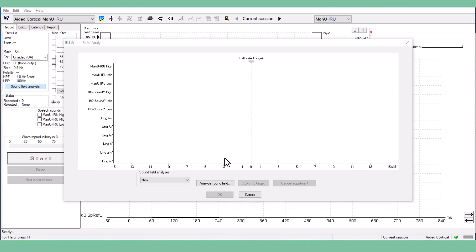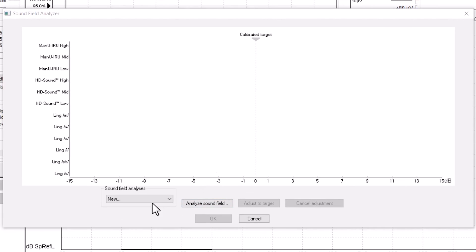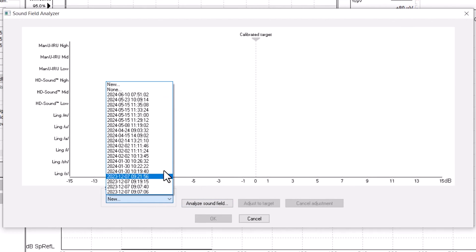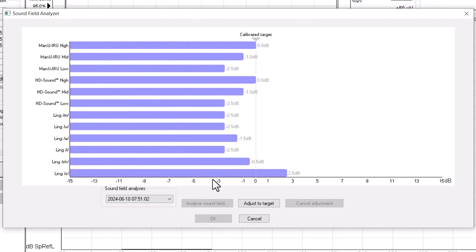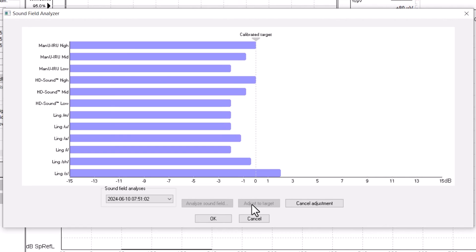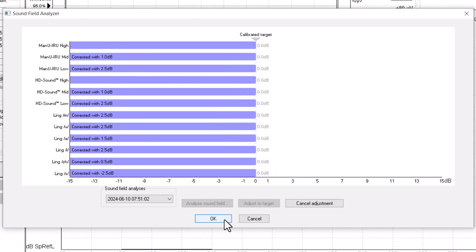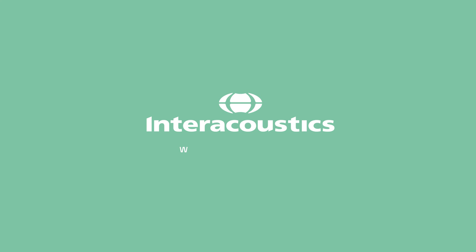If you want to use a saved Soundfield Analysis, click the drop-down menu and choose the saved Soundfield Analysis. Adjust to that target and press OK to save. This feature is useful when the equipment is frequently moved between different locations.